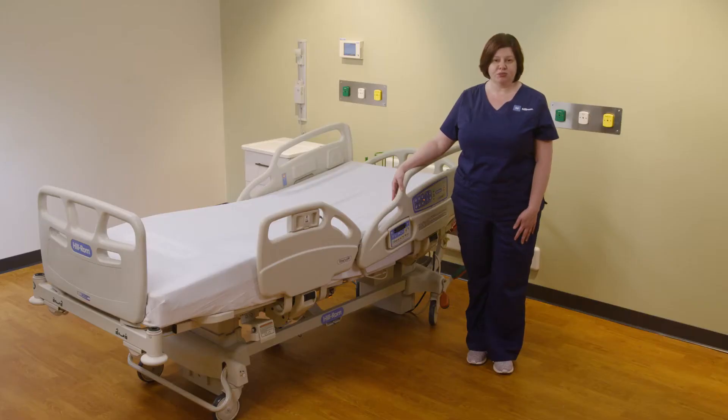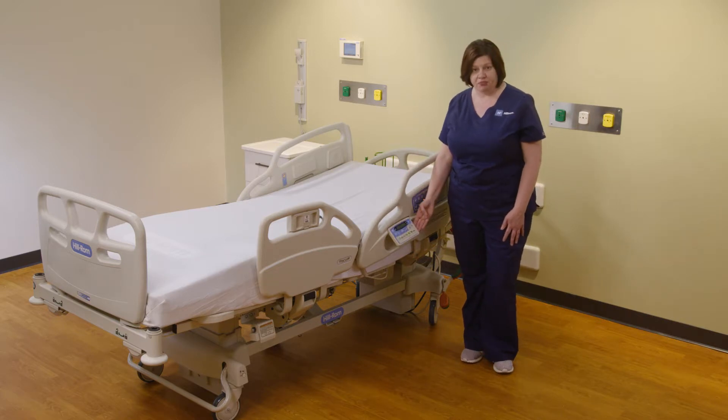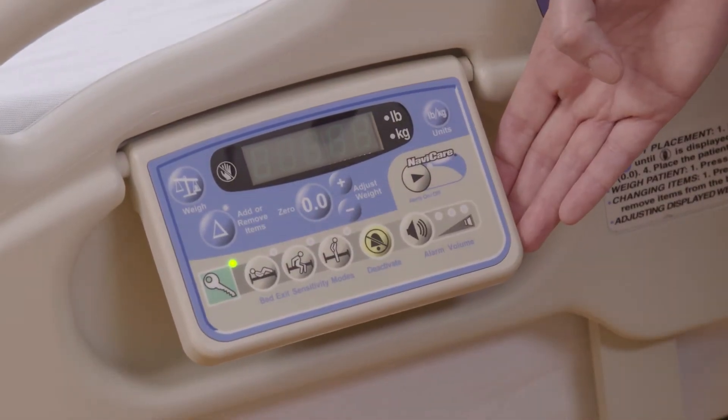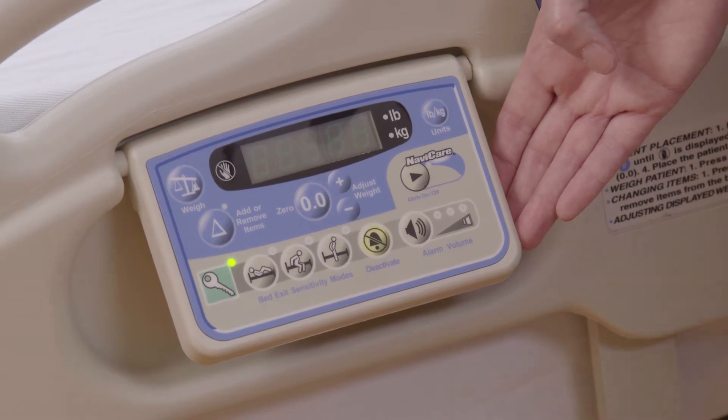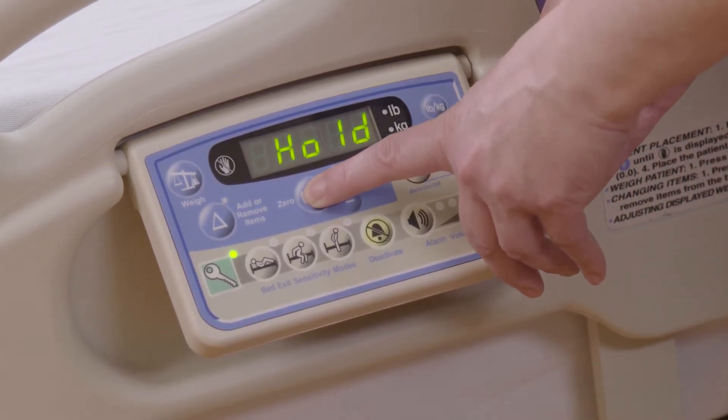First I'm going to show you how to zero the bed. You will walk up to the scale pod and activate it by pushing on the green key. When the green key is illuminated, you may then push and hold the zero button.